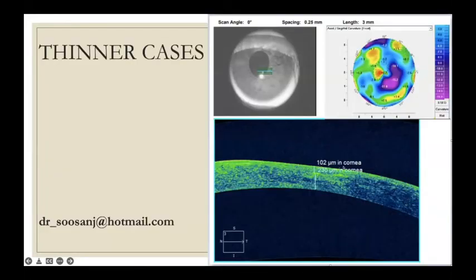This was a patient who had cerebral palsy and had a lot of difficulty being transported to the hospital, an adult male, actually, about maybe 22, 23 years old. For him, the option would have been DALK, taking into consideration only the 230 microns in this small area of his cornea. But what I did is an epithelial island combined with CACXL, contact lens assisted cross-linking, together with CAIRS, which gave us a good effect. And he's to this day good and very happy in his home.